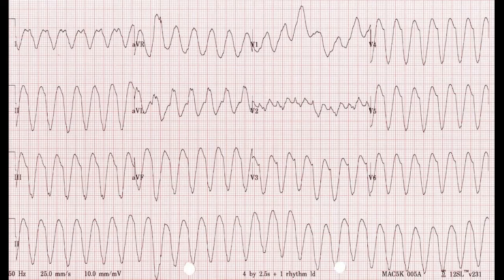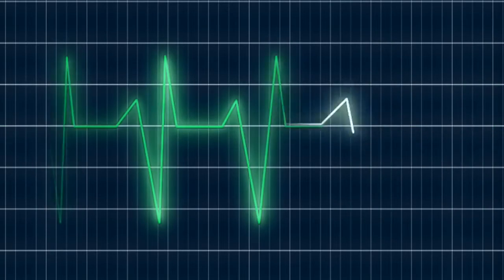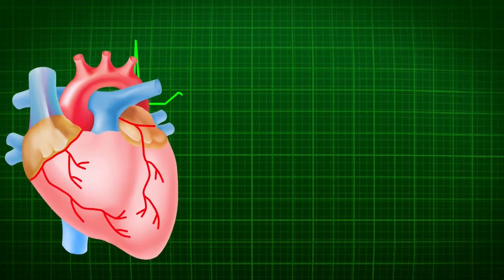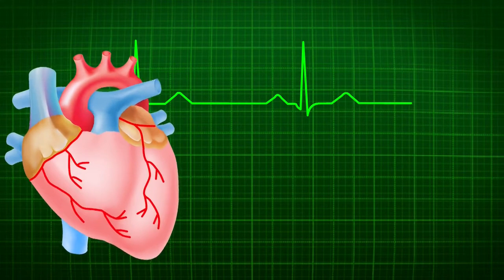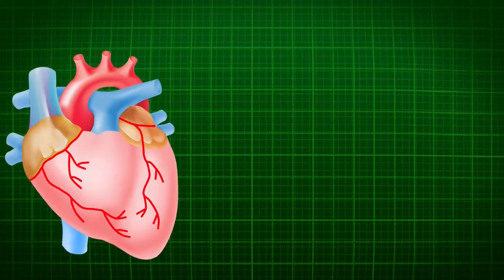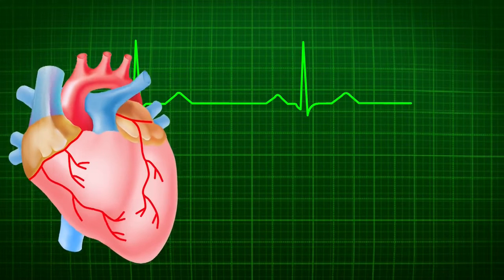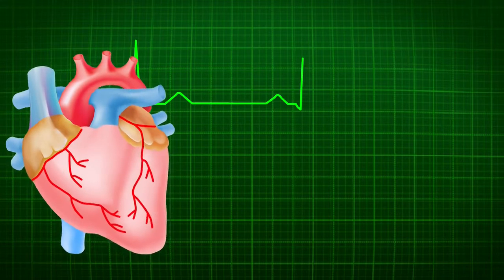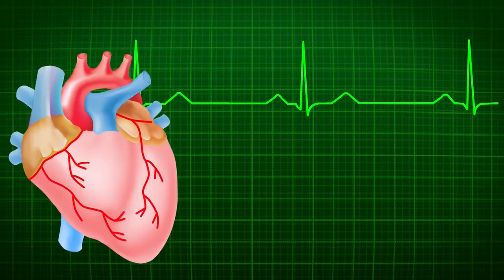What is concordance? We are talking about the concordance of the QRS complexes. If you carefully look at any ECG, you will see that the R wave is a positive wave, and Q and S waves are negative waves. Whenever there is a positive wave in the QRS complex, there is a negative wave as well — that is discordance, and that is normal. So in any lead in the ECG, you will find a positive reflection which is the R wave, and a negative reflection which is a Q wave or S wave, or sometimes both.